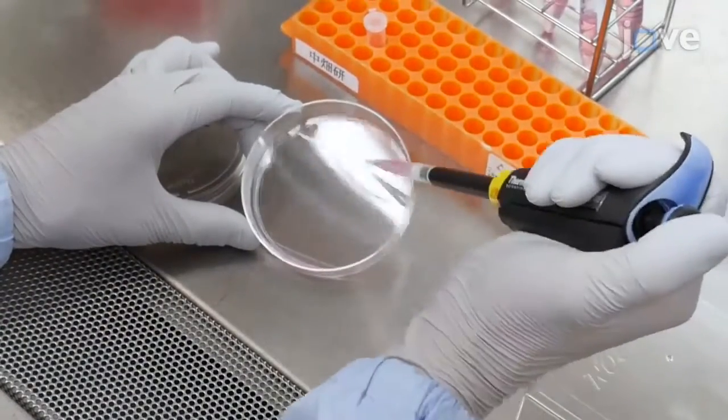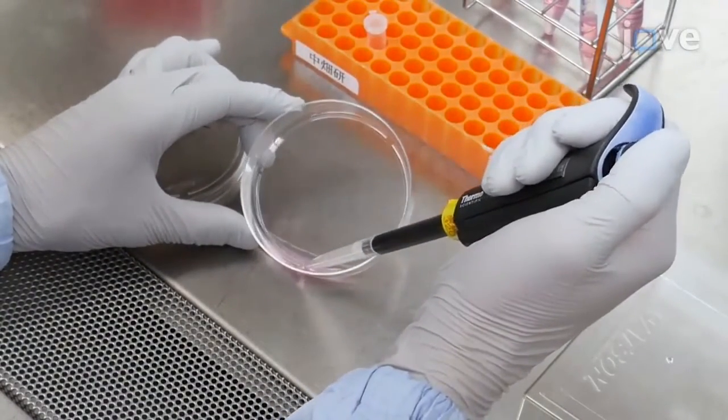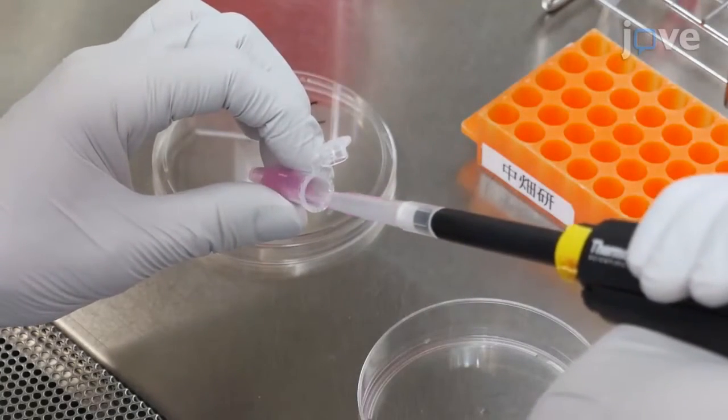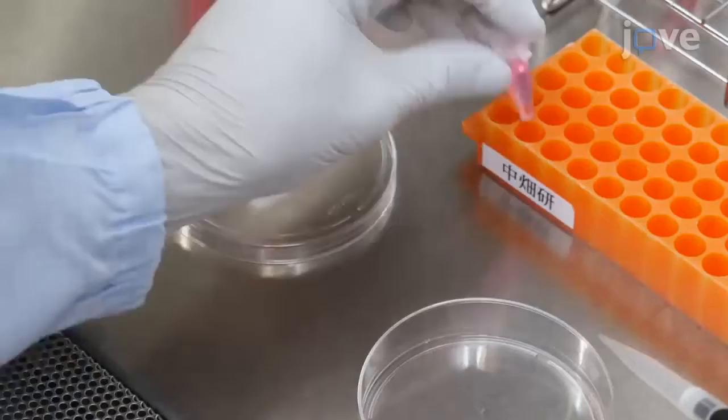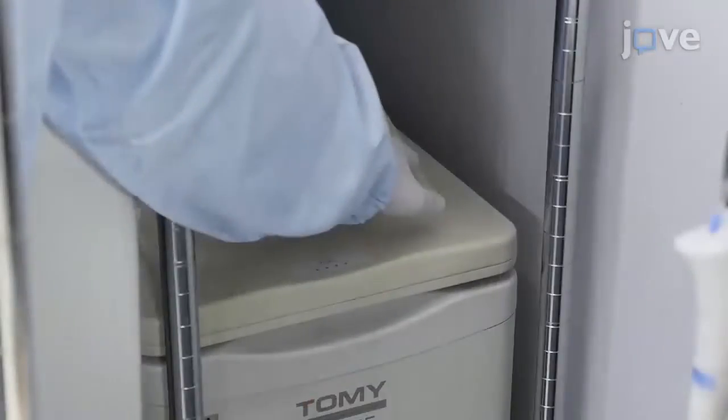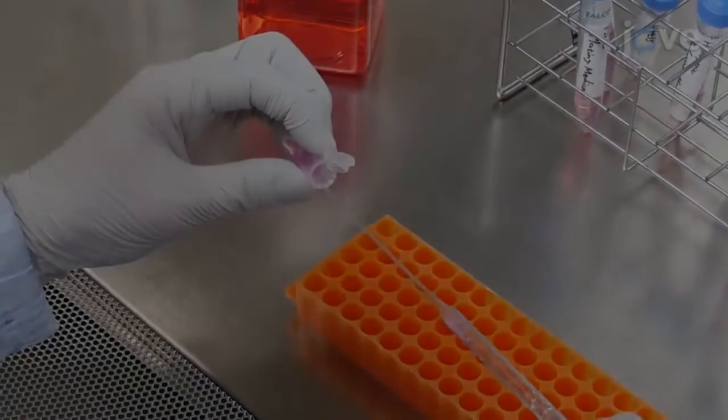Resuspend the cells in PSC maintenance medium and transfer the suspension to a 1.5 milliliter microcentrifuge tube. Centrifuge the cells at 200 times G for 3 minutes. Aspirate the supernatant.